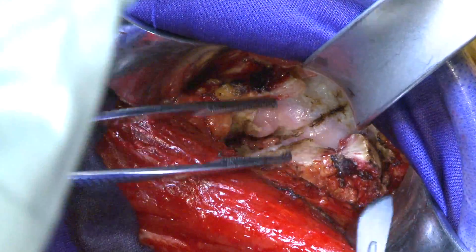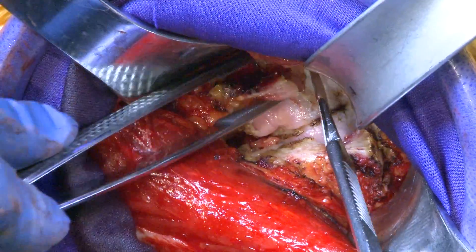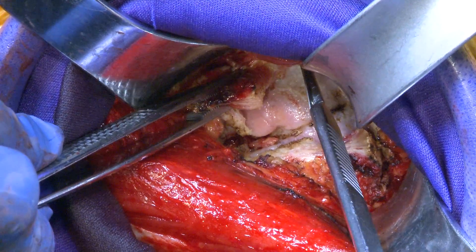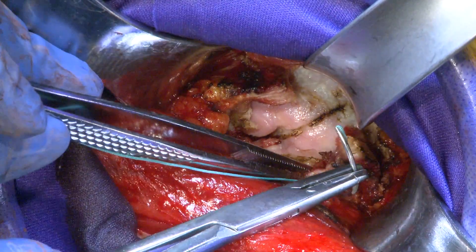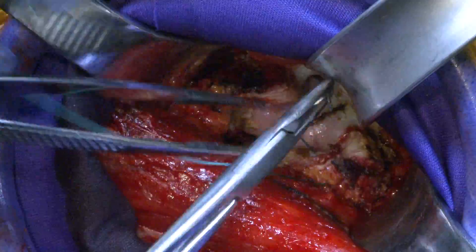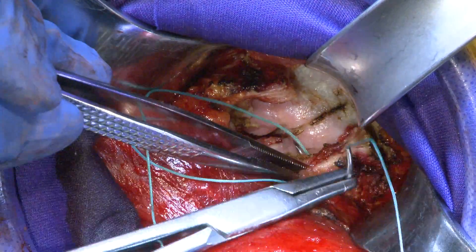I'm going to tee this open right along the acetabular rim — that's the medial tee. I've just opened this capsule up a bit, which will allow me to visualize the acetabulum and dislocate the head. I like to repair the capsule, so we're going to preserve this, put some stay sutures in here, and then repair the capsule at the end.